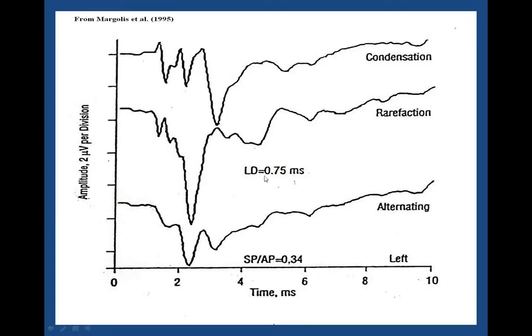And if this difference was bigger than about 0.3 or 0.4 milliseconds, that too is a positive finding for hydrops. If you use an alternating click, that difference is really masked out, and what you see is just the addition of two, for lack of a better term, phase disparate N1s that don't necessarily reflect an enlarged SP-AP amplitude.